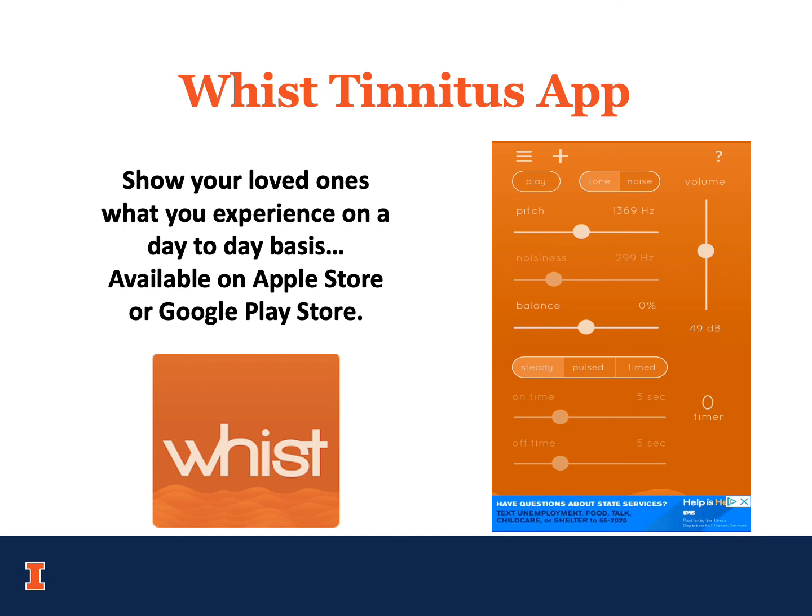What I like about it is that you can select the pitch, you just have to slide it. On the left-hand side, low pitches; maybe your tinnitus is high pitch, so you're more on the right-hand side. And you can also select the loudness level here under the volume control. Again, I just think it's a nice way to show some of our loved ones what your tinnitus may sound like, but not necessarily for therapeutic use unless you find that you like it.